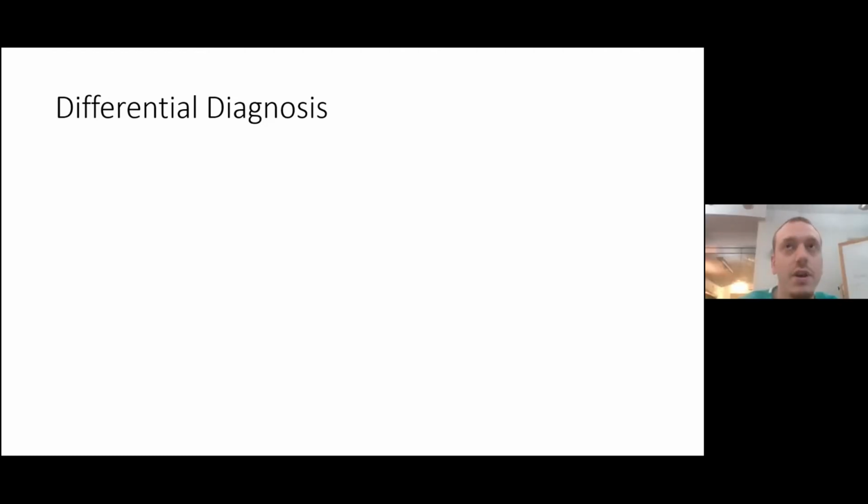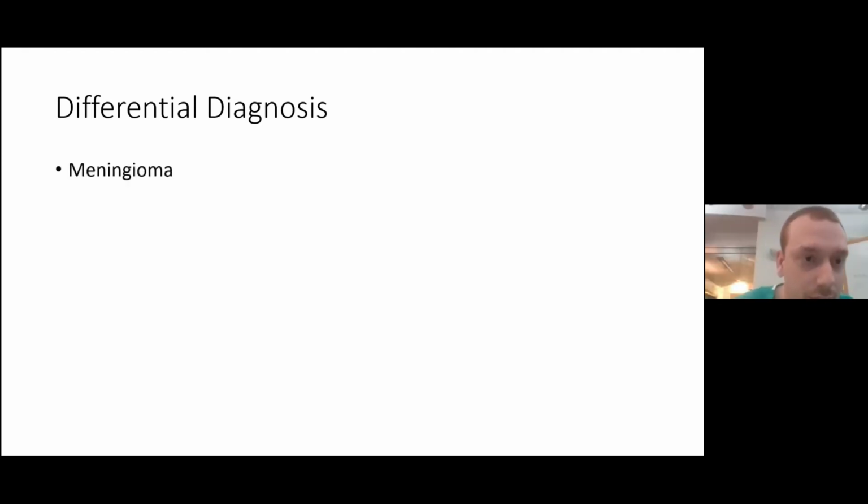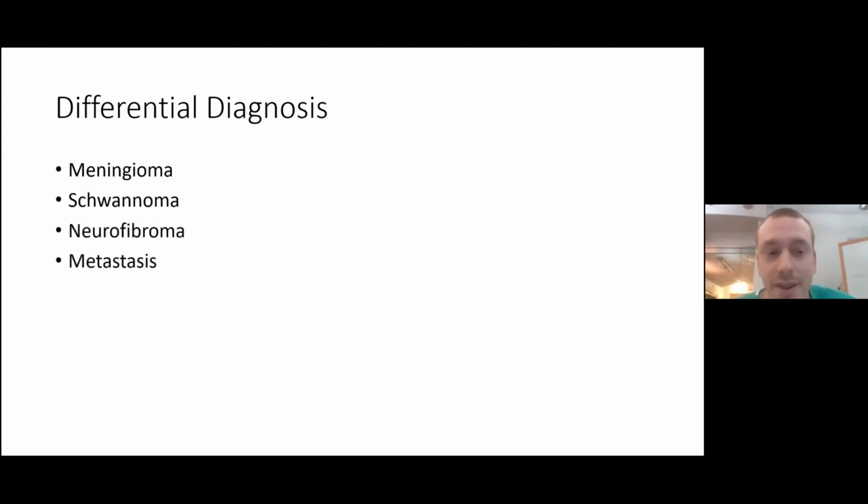Okay. So for intradural extramedullary, what's your top differential? Top two? Ependymoma and schwannoma. So schwannoma for sure. How about meningioma, right? Meningioma. Is ependymoma extramedullary or intramedullary? Yeah, intramedullary. Okay. So your top diagnosis is, as you said, going to be meningioma or schwannoma, and then less likely neurofibroma or metastasis.